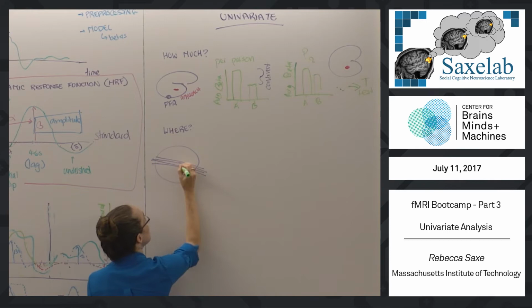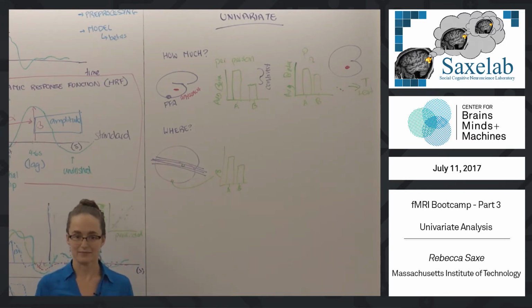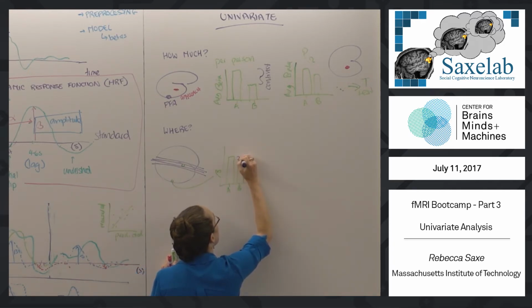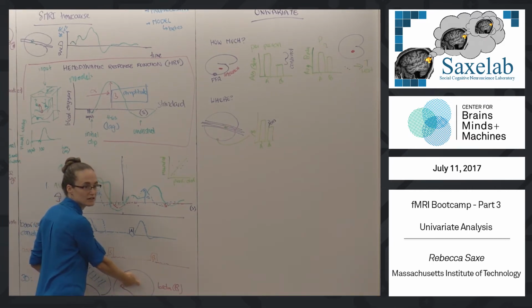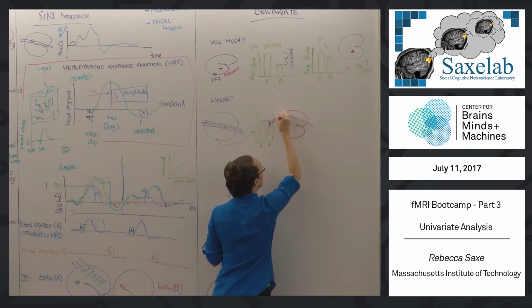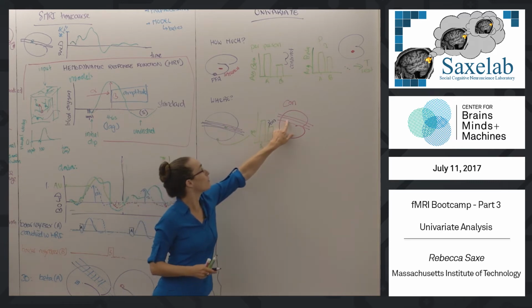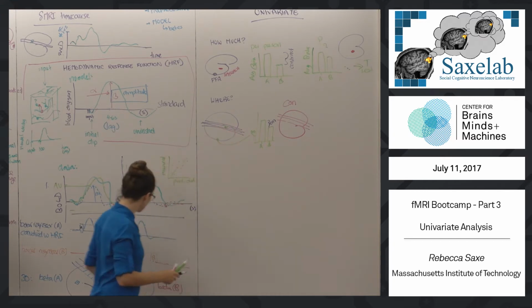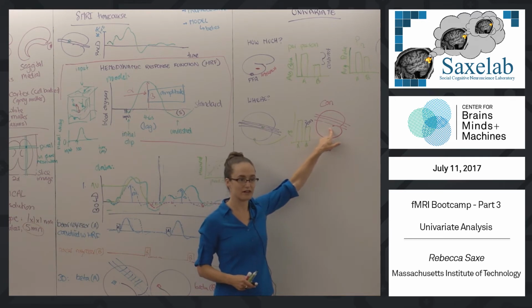So now, in every single voxel, the same analysis. Average beta for A, that's the beta value in that voxel, and the same for B. And so we can take these two images, and if we subtract them, literally A minus B, we have a new three-dimensional image, which is the contrast image, which is the value at each point of the contrast value in that voxel from the difference of the two. Is that clear? So literally at every point, subtract the value of B from the value of A, you get the subtraction, which is a con value.